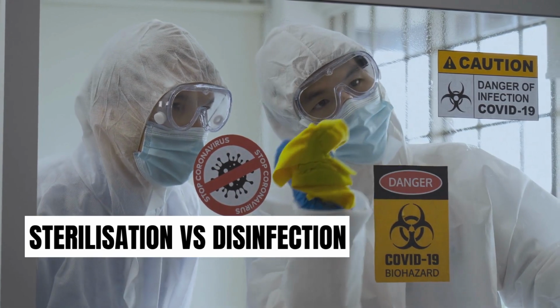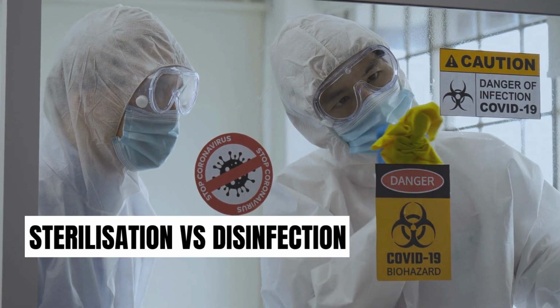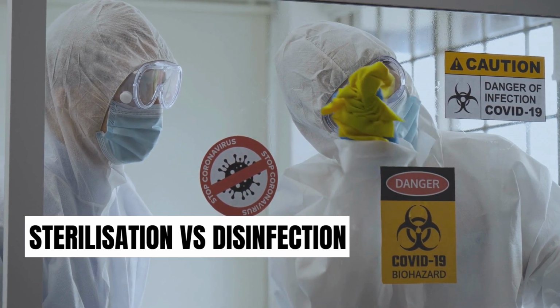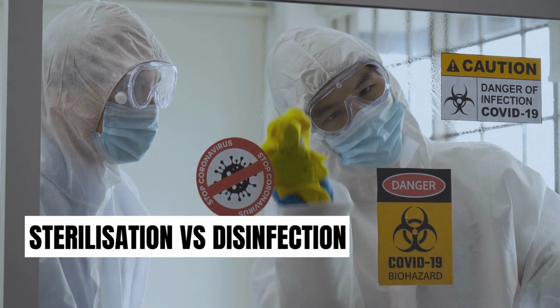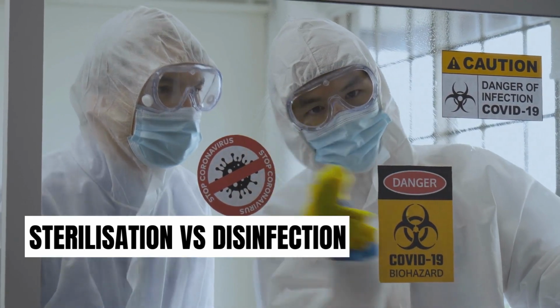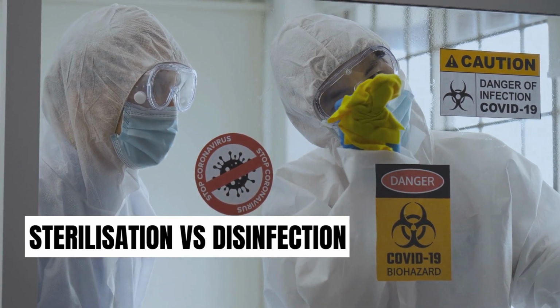Disinfection refers to the destruction of pathological microorganisms only. It is often a term applied to procedures that are incapable of destroying the spores. So when we say that we have disinfected an instrument, we mean that we have destroyed all the pathogenic microorganisms, but the spores may have been left behind.